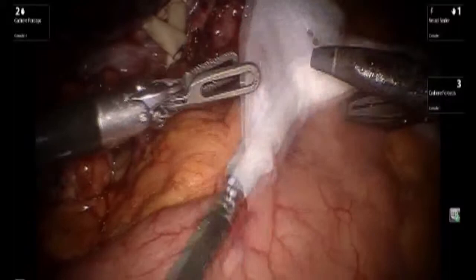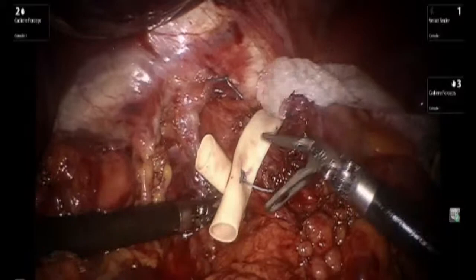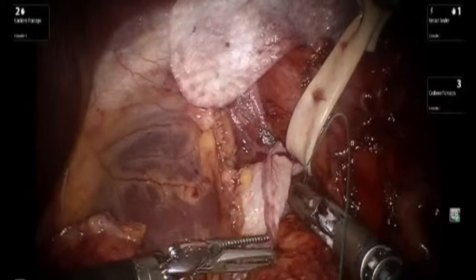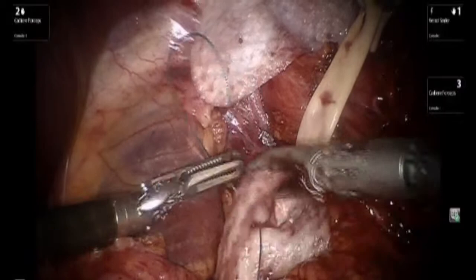A decision was made to utilize a biological mesh. The mesh is introduced and placed as a reverse letter C and does not place circumferentially around the defect. Please note that U-stitches are utilized in order to secure the mesh to the underlying structures.